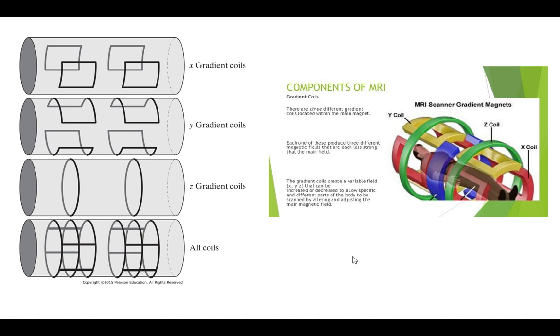It's not mentioned here, and it's a little bit deeper than they want to go in the book, but I think it's a good question. That's where all these shim magnets and everything else comes from. Trying to adjust it to make sure it's not going to be perfect, but that it's good enough. I see. So you'll take that, a few millimeters to whatever, depends on your system and what resolution you're looking at.